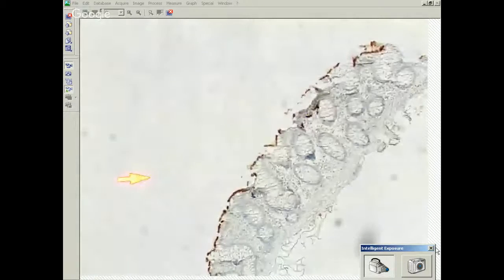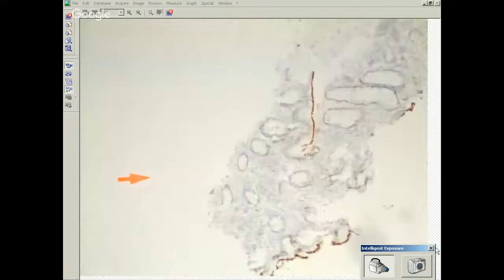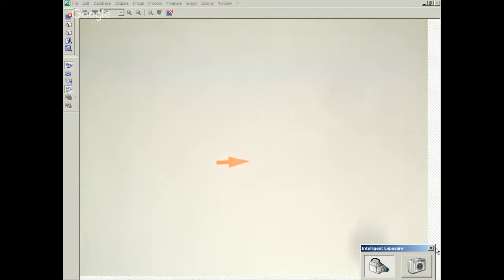Yeah, there's an immunostain for spirochete. It's good for all sorts of spirochetes. It works for syphilis, but it really highlights that fuzzy luminal surface of spirochetosis. All right.